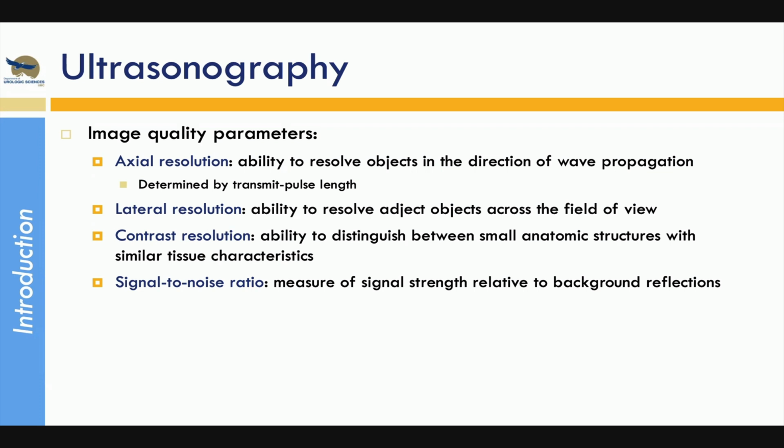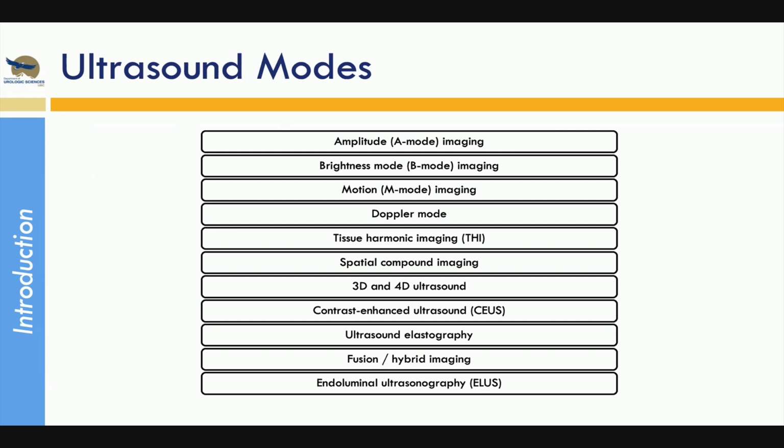In the next part of my talk, we're going to talk about all the different kinds of ultrasound there are. I think a lot of us, certainly myself, when we think of ultrasound, we think of the typical grayscale ultrasound when you stick a probe on someone and that's what you see. But a significant landmark in the evolution of ultrasound technology has been a transition from just static grayscale imaging to real-time imaging, a lot of improved resolution, and a lot of advancements, which I'll talk about now.